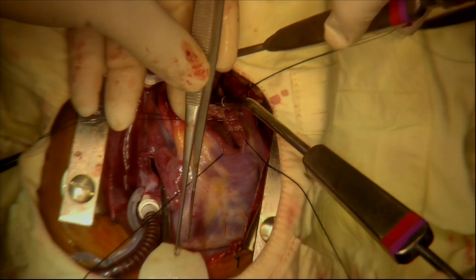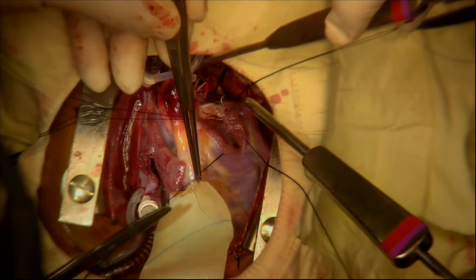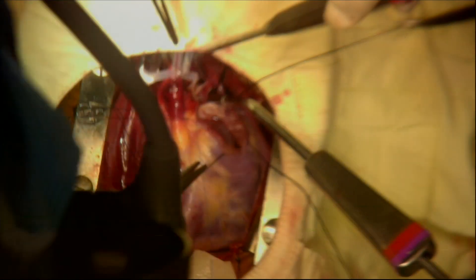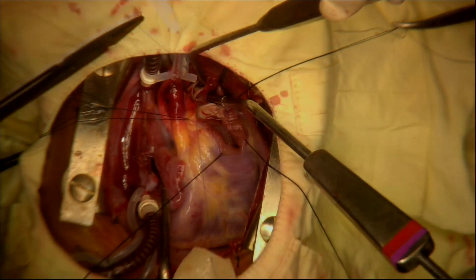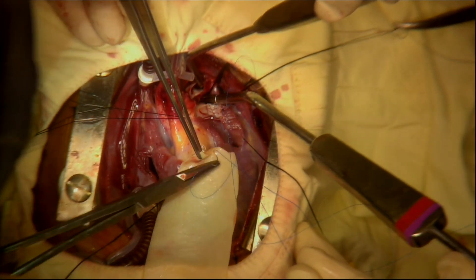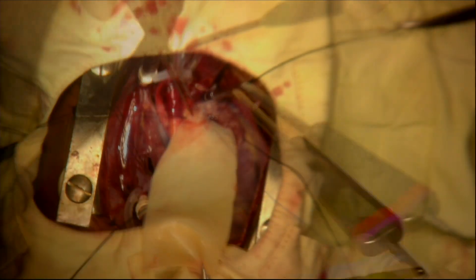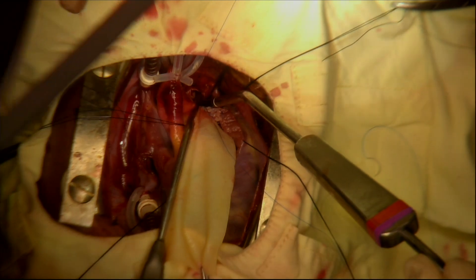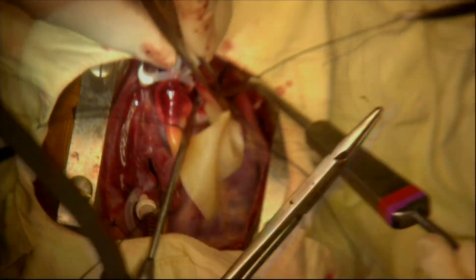The patch is sewn to the margins of the right ventricular outflow tract and the pulmonary arteries using a single layer continuous over-and-over suture made with continuous prolene monofilament. The first sutures between the patch and the corner of the left pulmonary arteriotomy are made at a distance. The patch is then gently parachuted down into place and the suture line is continued up the right side of the pulmonary arteriotomy.